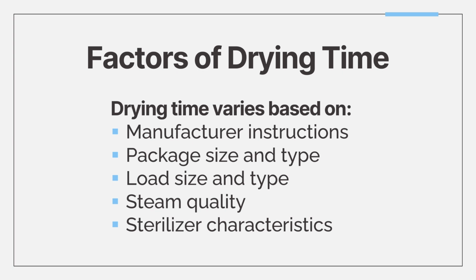We have to use the correct dryness fraction, which we have no say in the matter, right? We don't customize the parameters ourselves as the sterilizers. That is above our pay grade. It is always going to be up to the healthcare facilities, MDRD supervisor, manager, and they have to talk to the proper engineer in charge of these situations, which is typically someone from that machine's manufacturer.